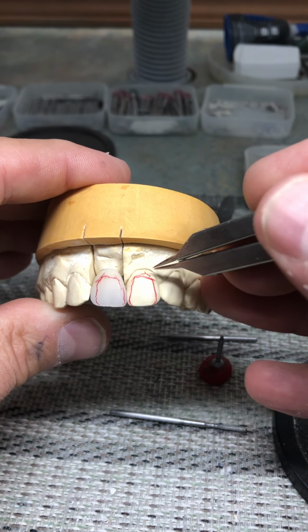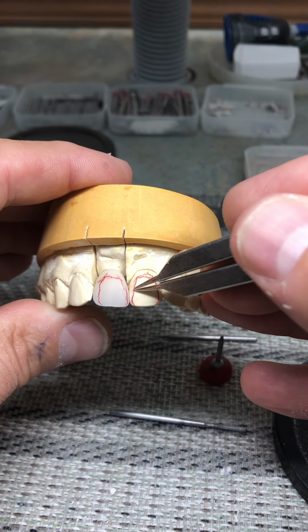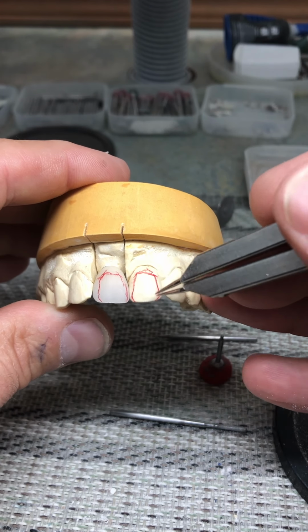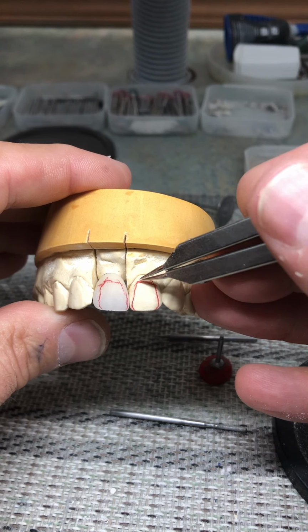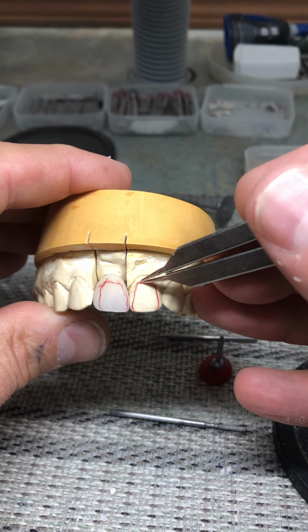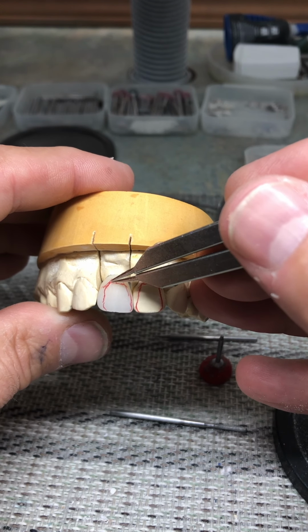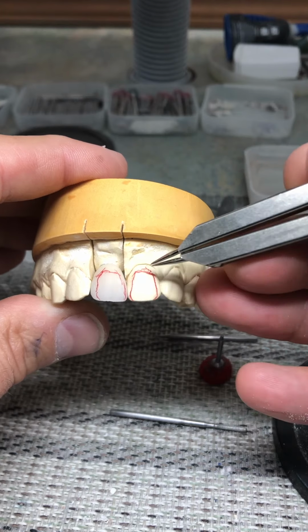The gingival height, which is where the crown seems to begin, is the area of the tooth that our eye perceives to be the contour of the tooth. It's similar, but if you notice, the zenith of this contour is more towards the mesial, and the zenith of number 8's contour is more towards the distal, so this needs correction.